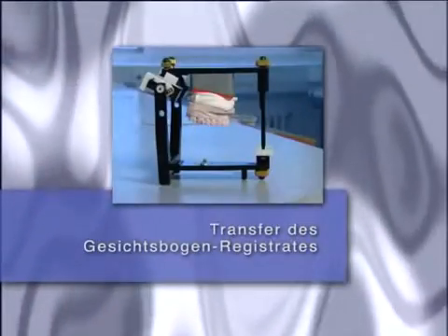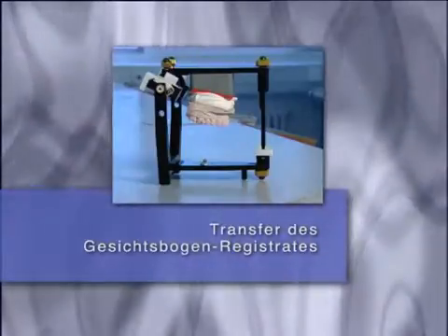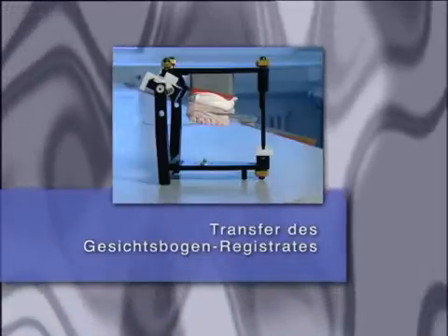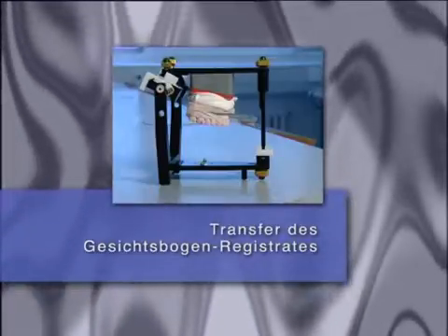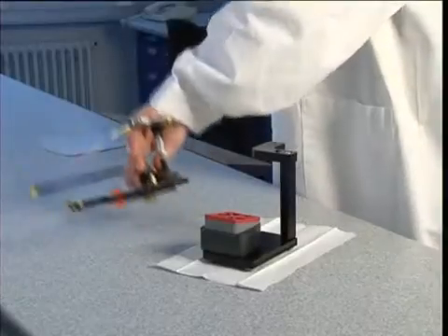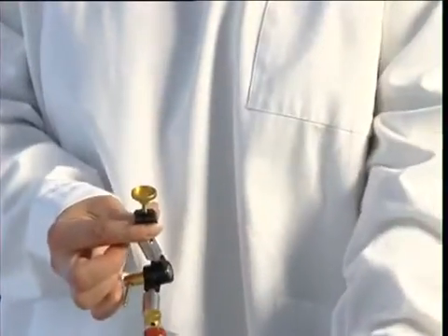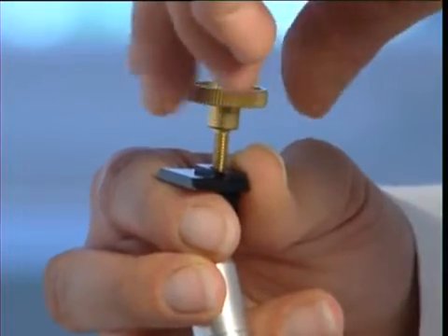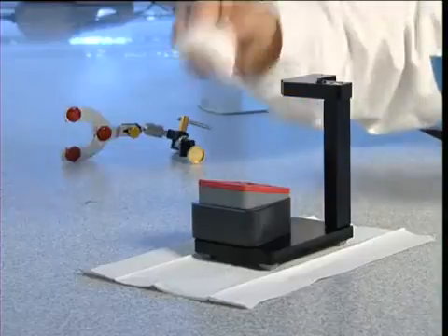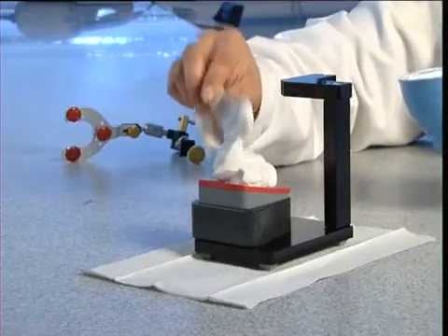Once the cranium axis relationship has been recorded with the facebow, the facebow can be fitted to the articulator for transferring the upper model directly, or the registration mounted in plaster for transportation using classic methods. This involves removing the joint support and bite fork from the facebow and sinking them into creamy Artifix plaster slurry on a reference AB stand.